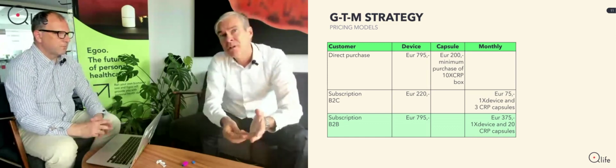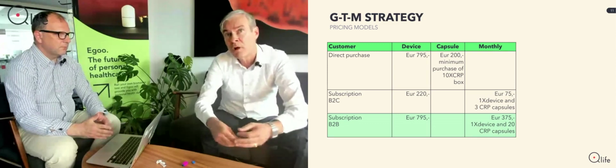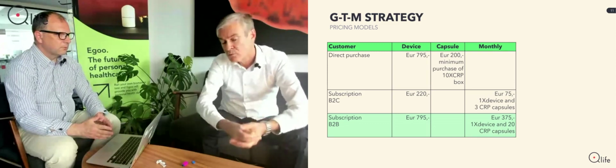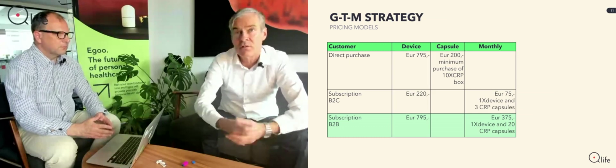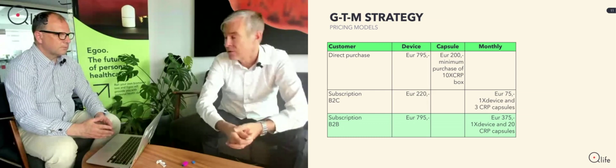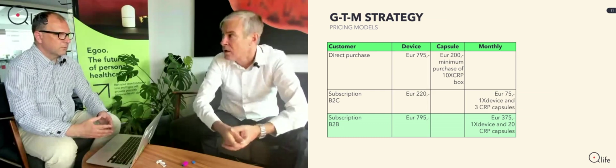And again, we encourage that you get these 3 capsules per month, especially if you have an autoimmune disease or chronic disease, or basically are interested in monitoring your health. It's really nice to trend yourself and see if your CRP level is trending up or down.